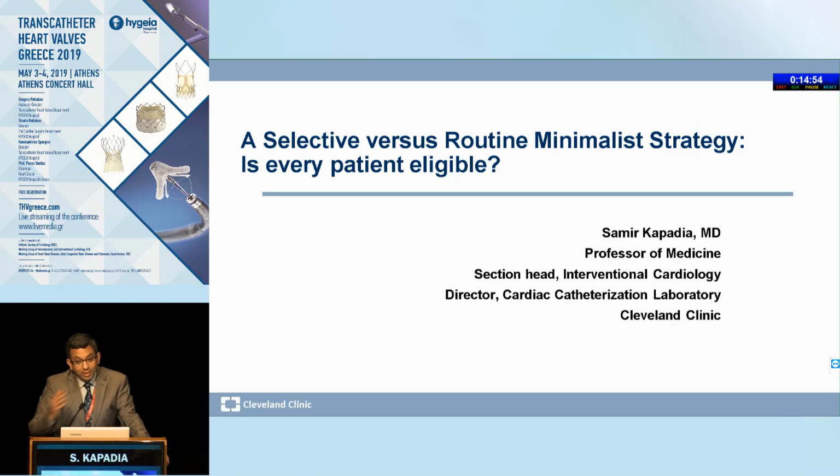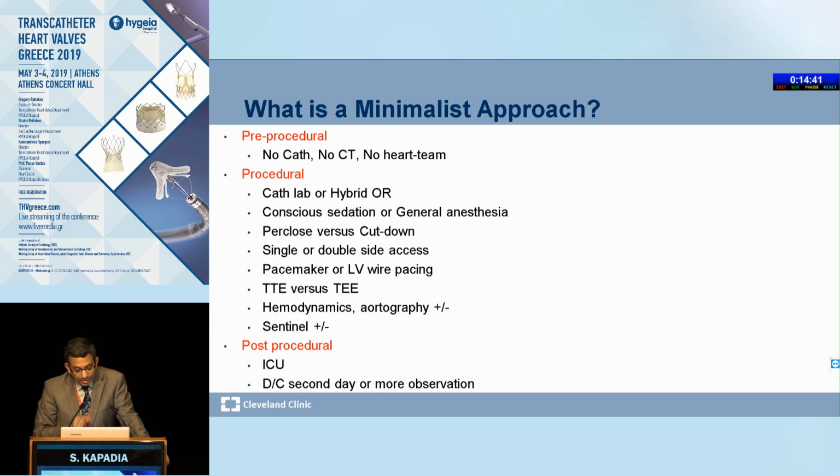What I'm going to talk about, and Dr. Kleiman just mentioned to you that he does all his cases with general anesthesia. So this is what we should do or not, and what are the different ways. So the idea is a minimalistic approach or not. A lot of people describe minimalist. What is a minimalist? They say pre-procedural minimalist.